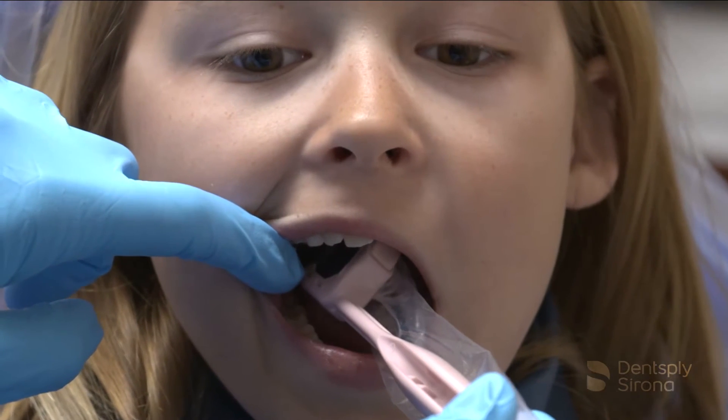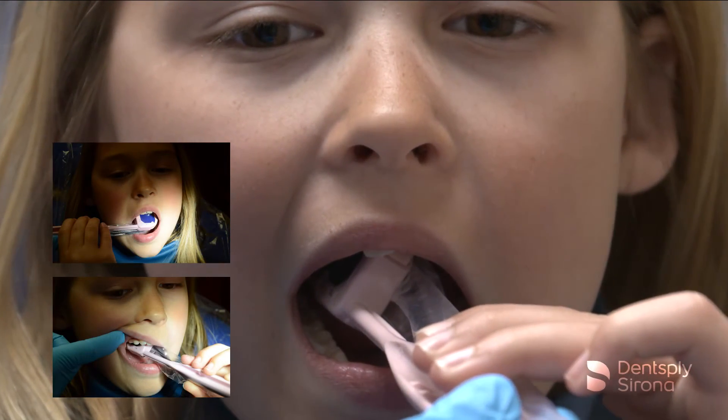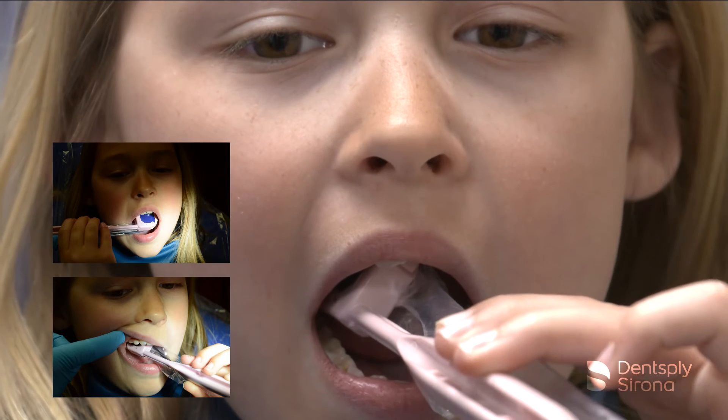Position the holder in the patient's mouth and have the patient or parent hold the comfort wand holder in place. Align the PID and the image is ready for capture.